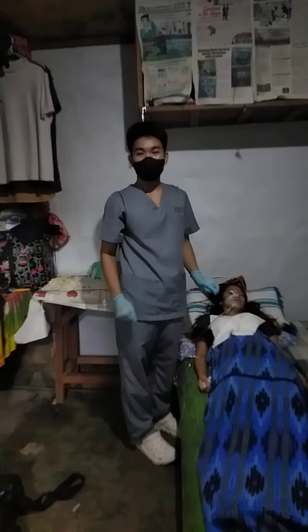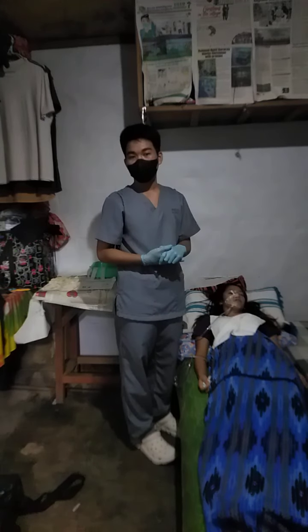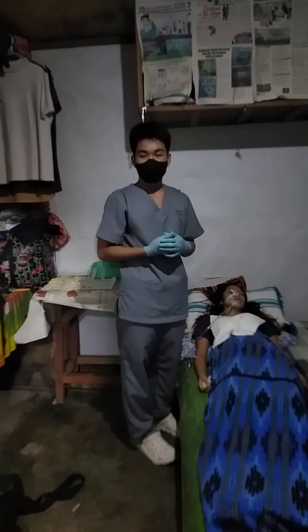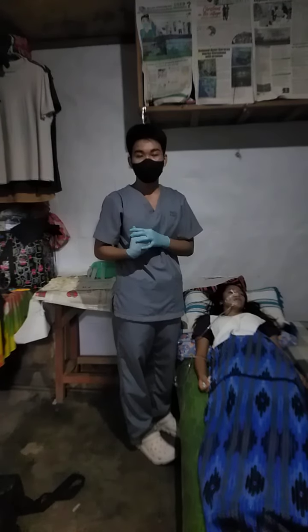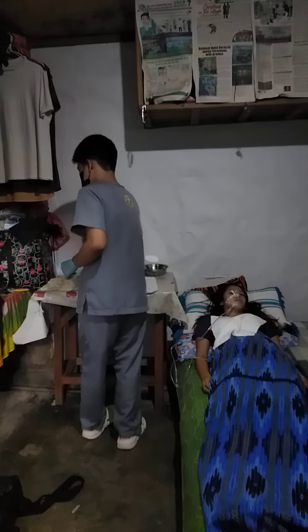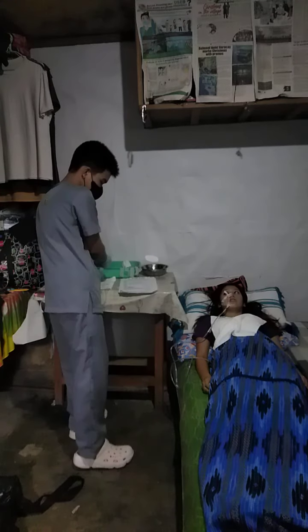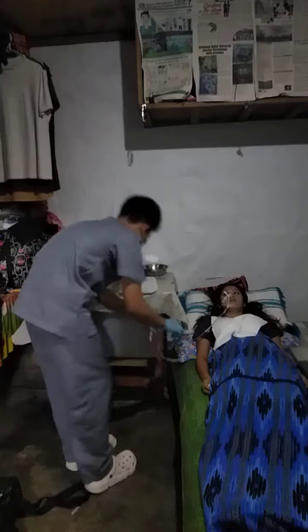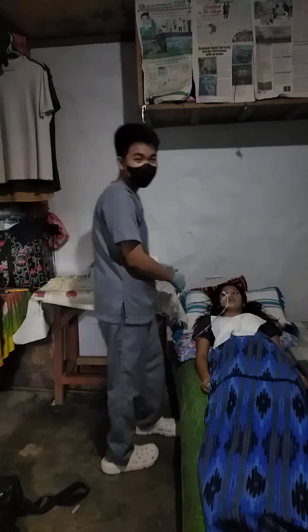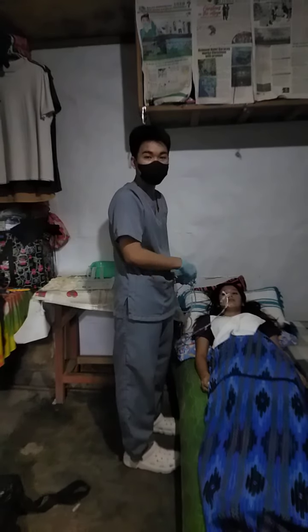Then attach the syringe to the end of the tube and aspirate a small amount of stomach contents. The tube is in the stomach if its contents can be aspirated. The pH of the aspirate can then be tested to determine the gastric placement. So this is the syringe. Measure the pH of the aspirated fluid using pH paper or a meter.